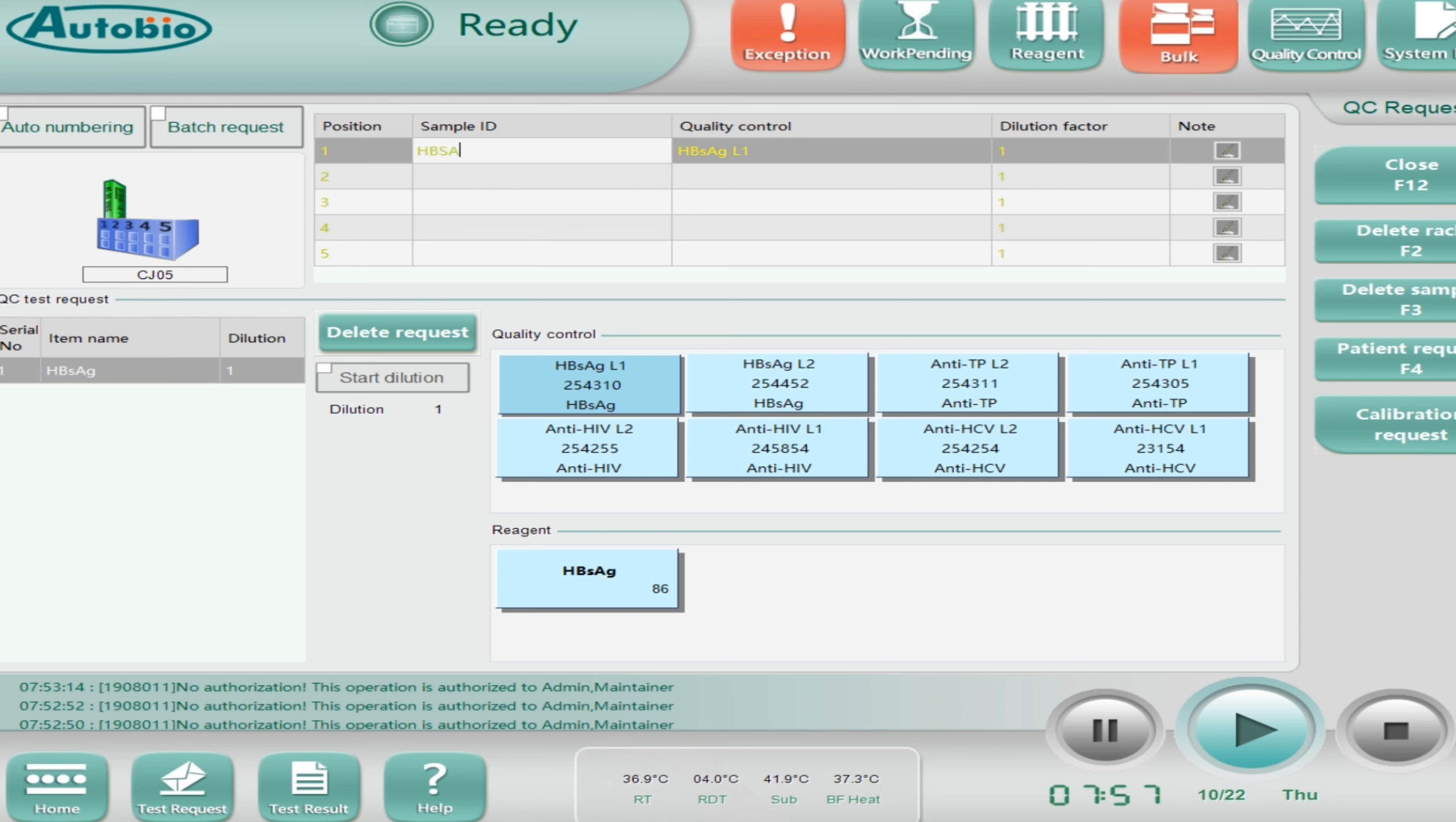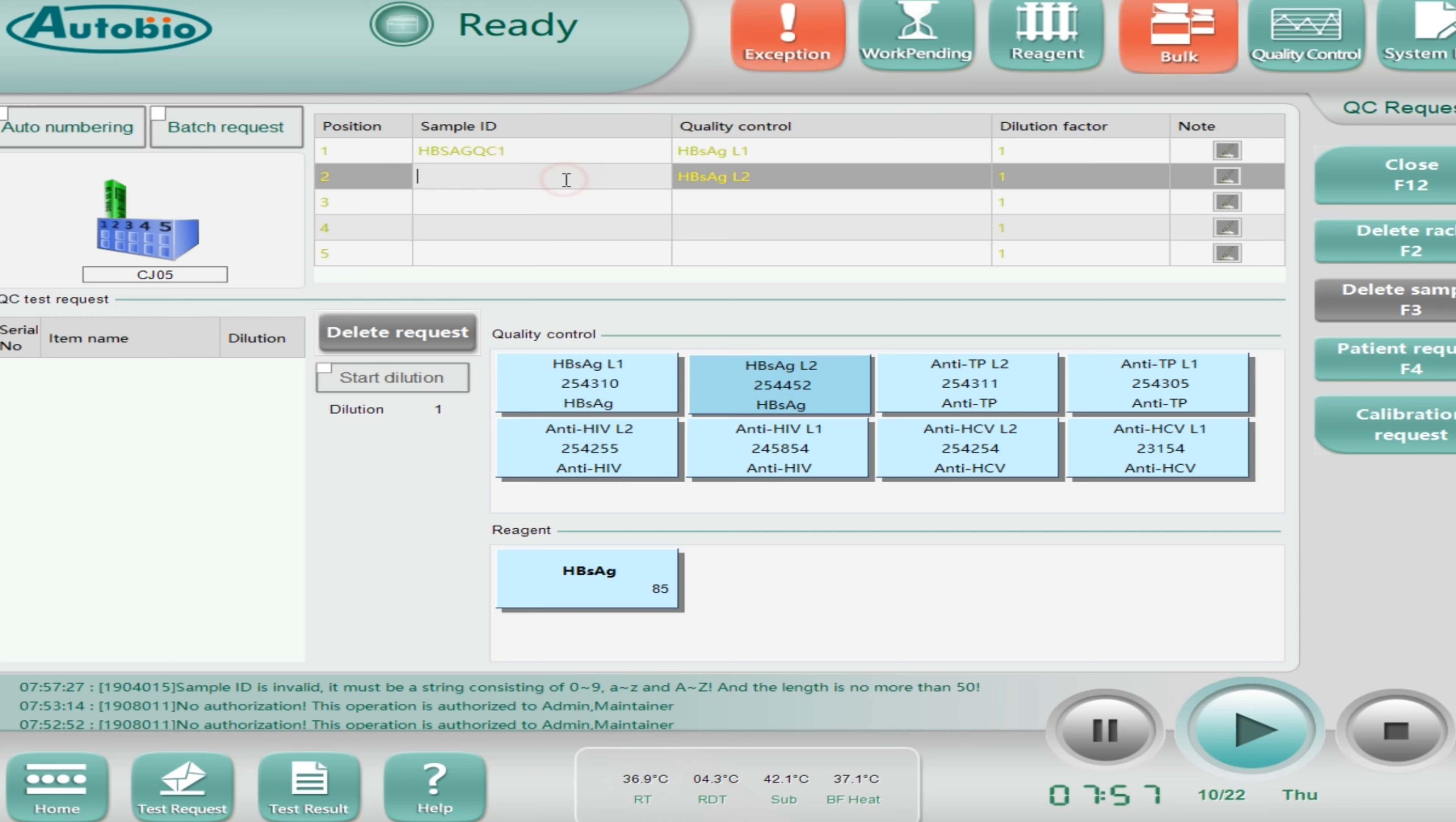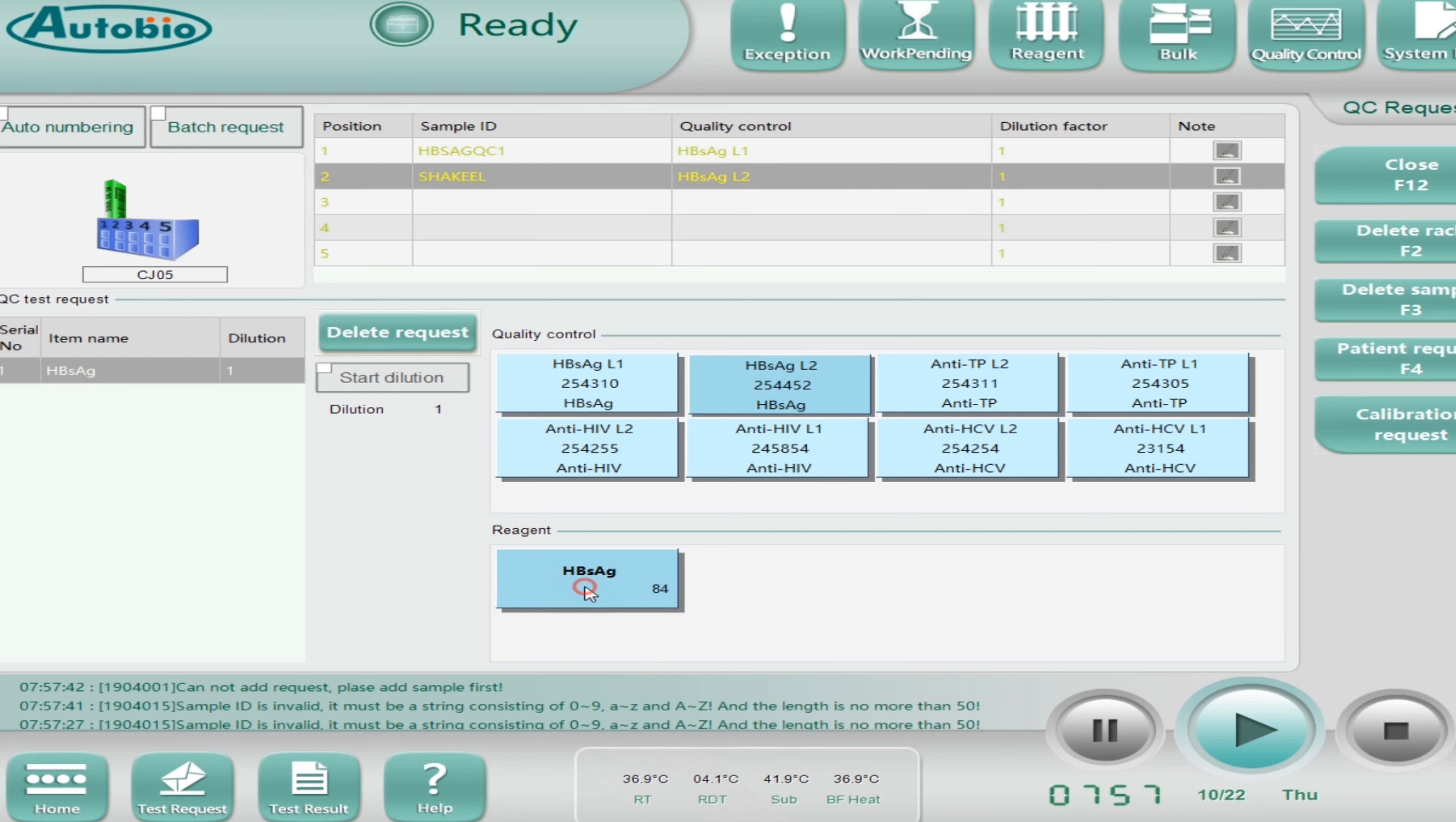Now let me show you how to run the quality control. Click on QC request and here use the barcode reader and scan your rack. I'm just going to type it, for example CJ and any wording. Then select the test, enter the sample ID which is basically QC ID.